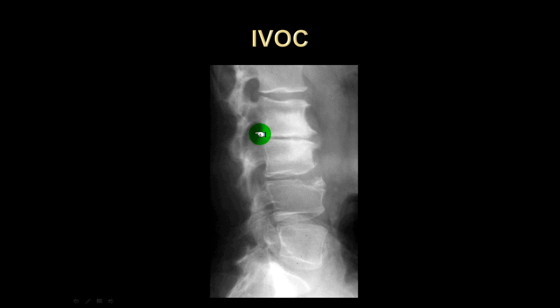along with small osteophytes projecting from the posterior inferior aspect of L2 and, to a somewhat lesser extent, from the posterior superior aspect of L3. In addition, and finally, there is a horizontally oriented vacuum phenomenon within the disc space at this level. Similar but less severe changes are seen at the L1, L2 level, absent the vacuum phenomena and posterior osteophyte formation. The intervertebral foramen at the L2, L3 level is narrowed, obviously, by these posterior osteophytes, which should lead you to a search for compressive neuropathy, compressive radiculopathy, although in this instance the patient is neurologically intact.